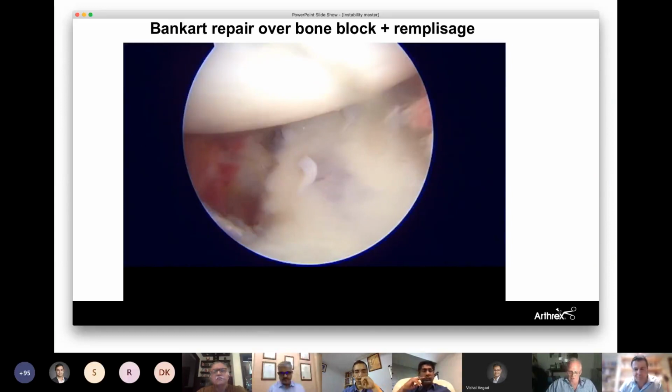Yeah, thanks, Mark. There is a question coming forward, and it's actually related to Latarjet procedures. What is the role of the plate in a Latarjet procedure? Should it be used, and why? I think it was meant the Giacomo plate. It gives better compression to the block and you have maybe less risk to fracture it, I think.